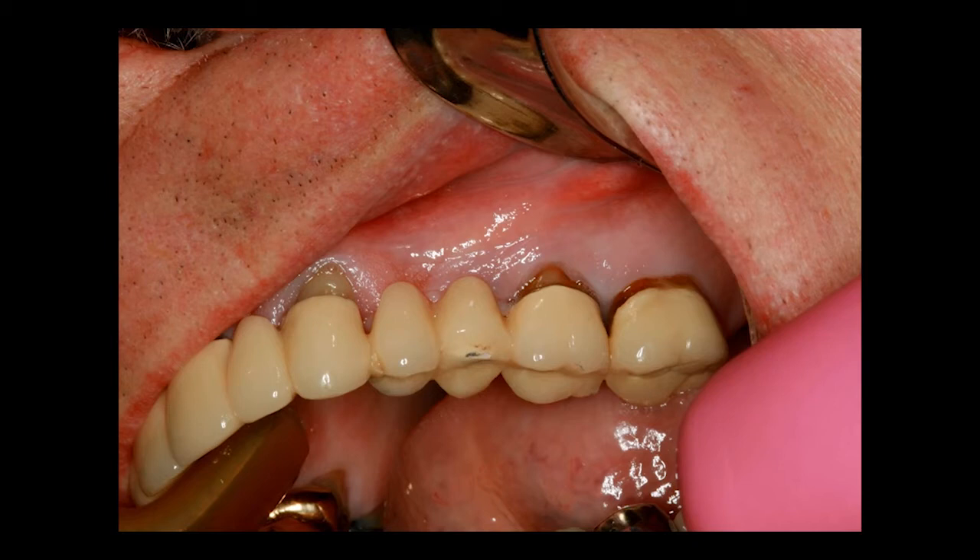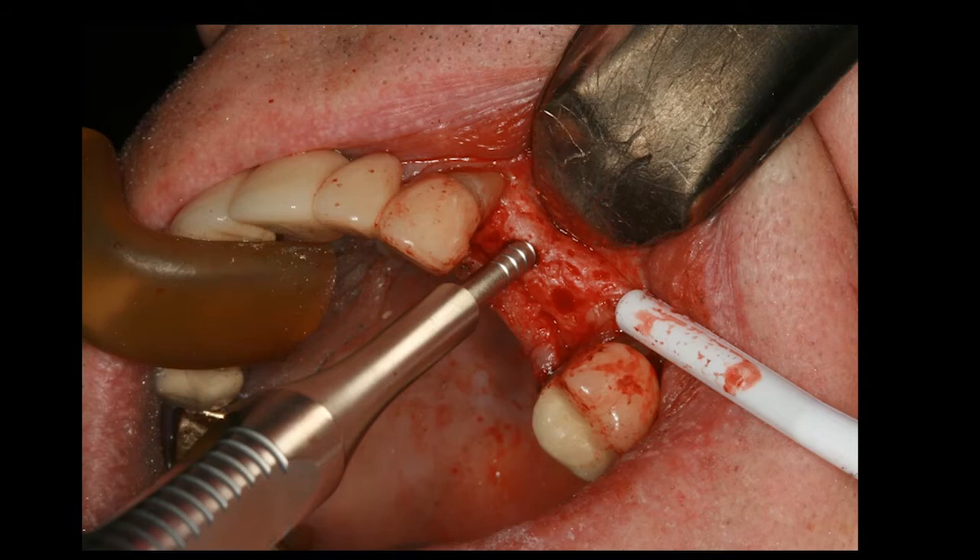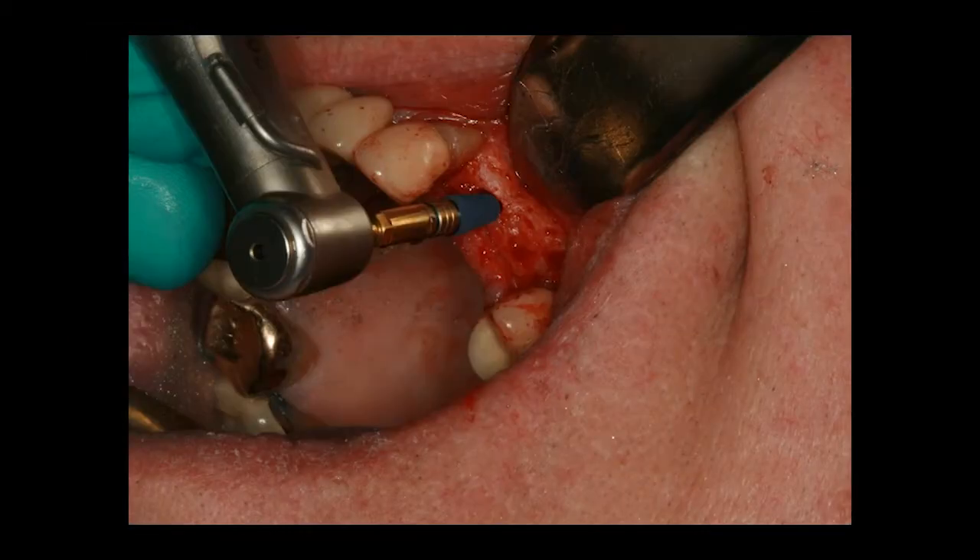I'm going to go through the steps of this case. This patient has a failing fixed bridge, and we're going to section the bridge on both sides. We're using osteotomes to create the osteotomies — we made our pilot drill, and now we're doing the rest by hand. These osteotomes come in different diameters, starting at 2.8 and going all the way to 5.6. Lately I'll place one implant, then come back and place the other one instead of trying to do both at the same time.